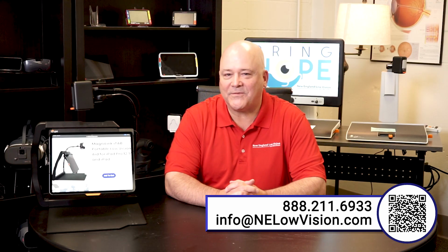And that's it. All right, so that about wraps it up for our introduction to the MagniLink iTab.